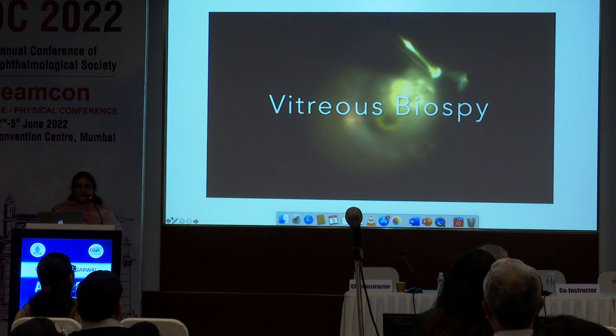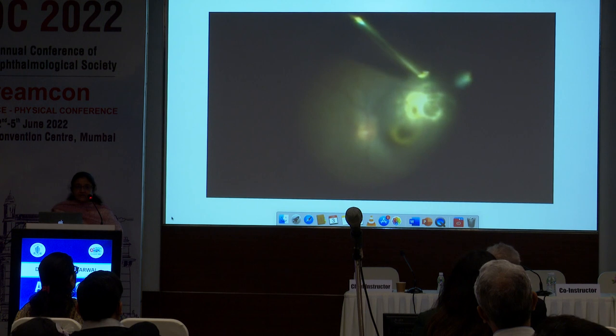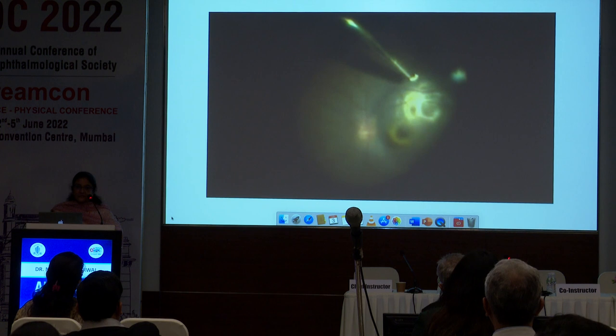So we went ahead and did a vitreous biopsy. And we just collected an undiluted sample going very close to the lesion. I did not have the heart to collect the sample from the subretinal space because he was a young child. So I just restricted myself to collecting an undiluted vitreous sample going as close as possible over the lesion.